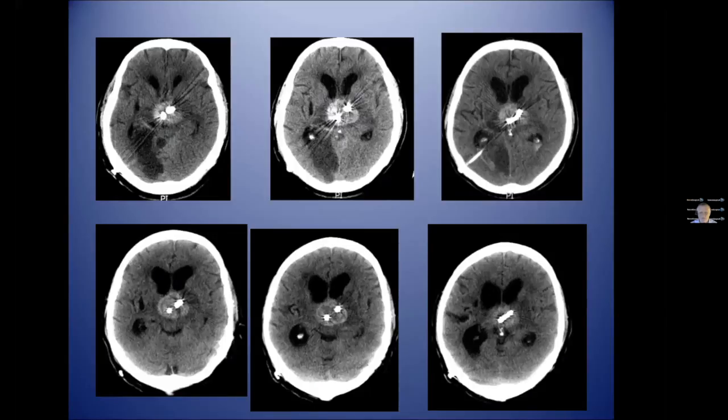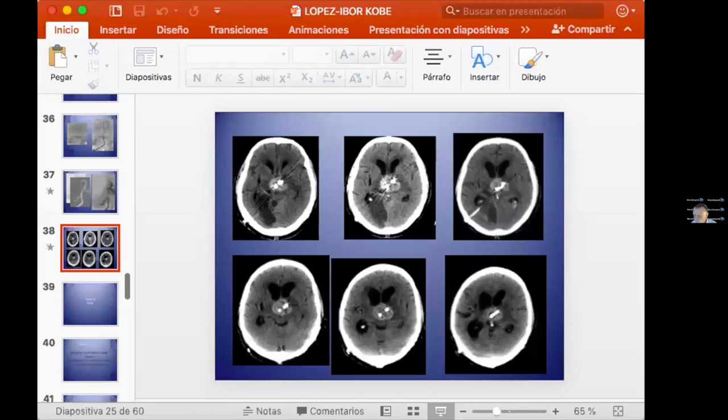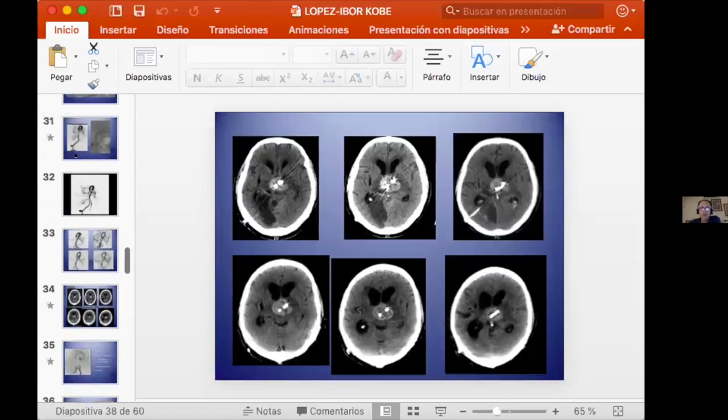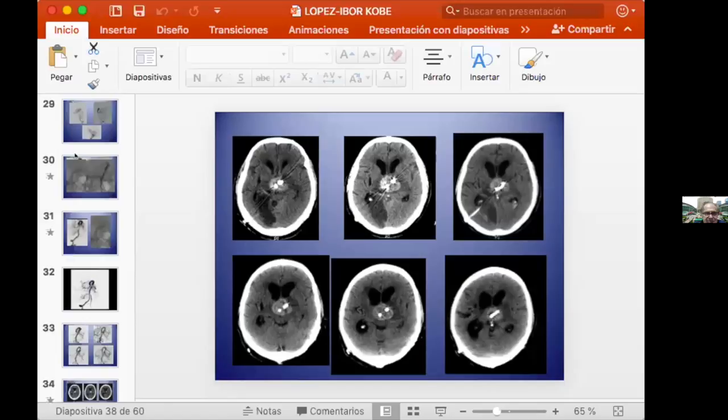Okay. Do you have any comment? Does anybody have comments for Luis? What was the site of this aneurysm? I was not careful in the beginning. Is it the basilar bifurcation aneurysm? No. It is a partially thrombosed basilar bifurcation aneurysm with the channel inside it. No. You take a look at the angios. It's thrombus, partial thrombus, but in the distal part of the basilar artery, no bifurcation.